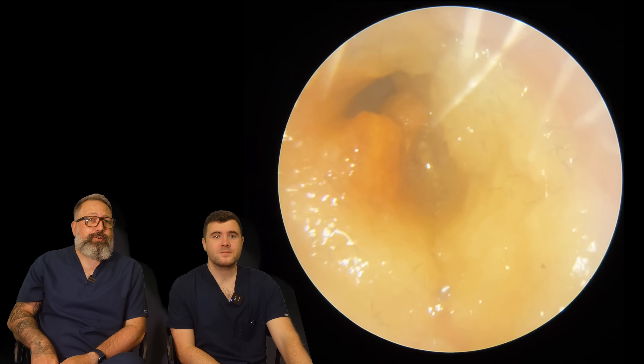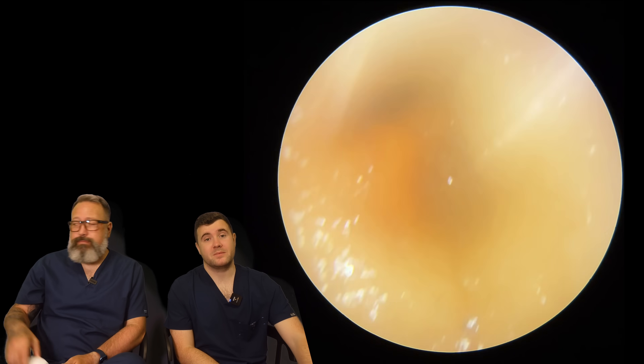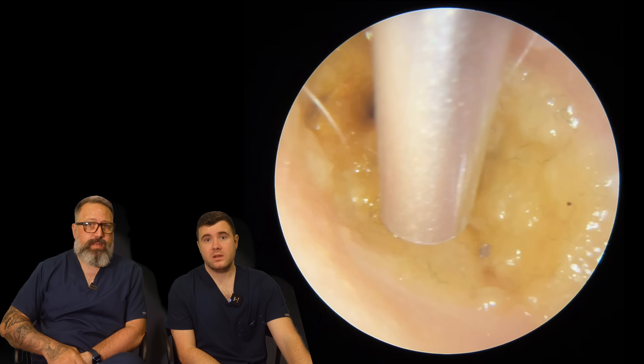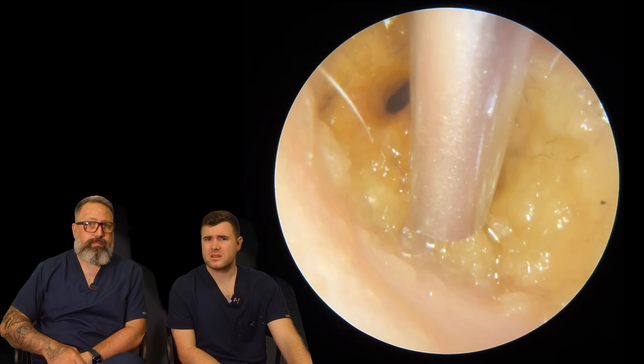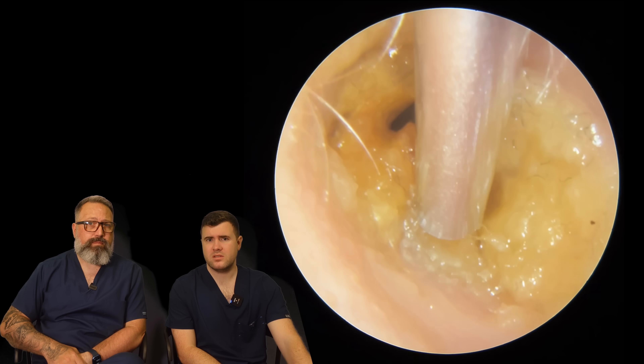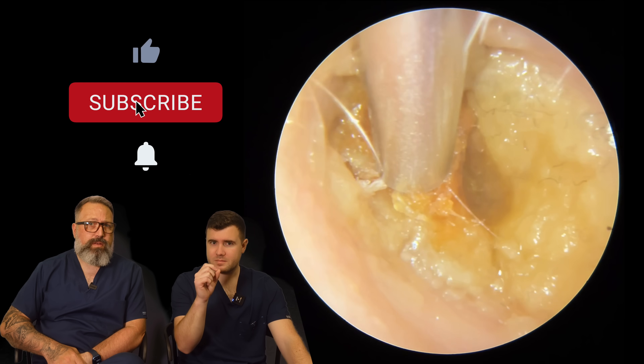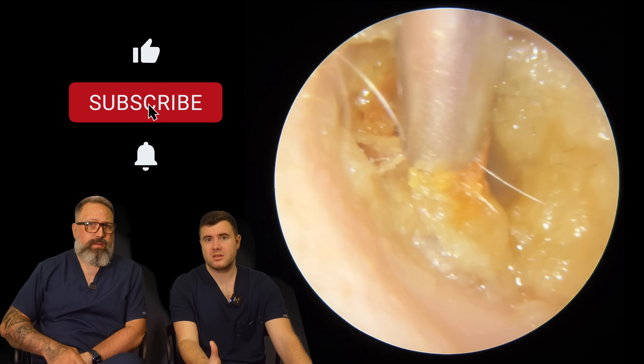Hi everybody, my name is Rhys Barber, I'm one of the audiologists here at Audiology Associates. And my name is Taylor Green and this is another patient of mine. We have, very similar to yesterday's video actually, there's a very soft and squishy plug of a little bit of wax but mostly skin in this one.